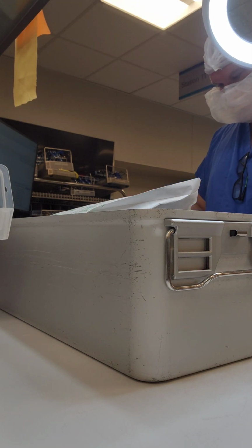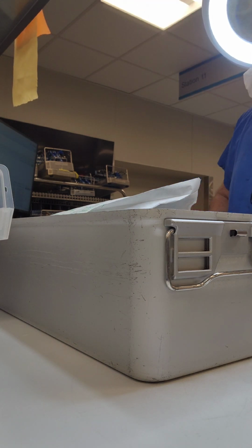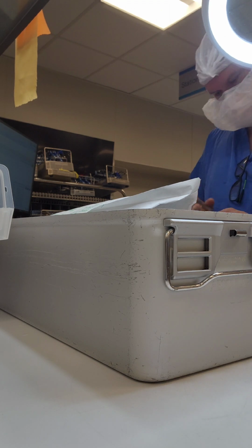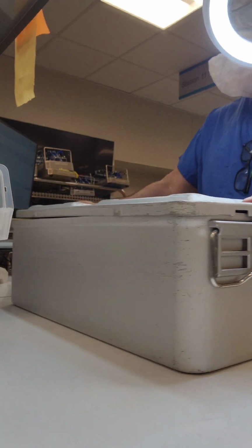As you can see, I am putting the other filters on the lid here. Checking those retention plates, make sure that they're clean, that there's no cracks or chips in there. Doing my little DJ spin to make sure that it's on there correctly and secure. And then let's put this lid on.